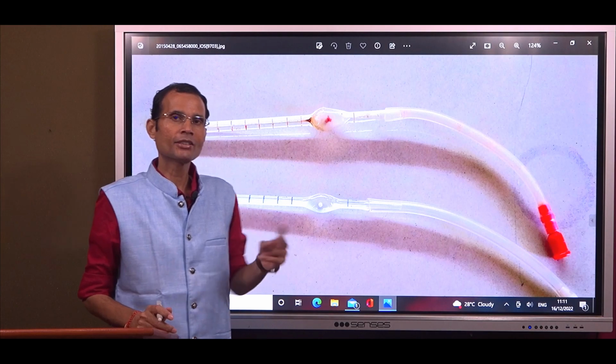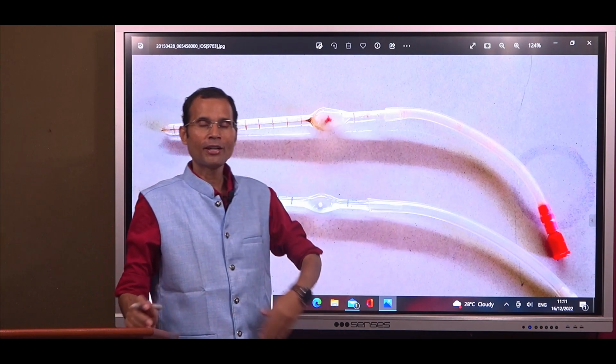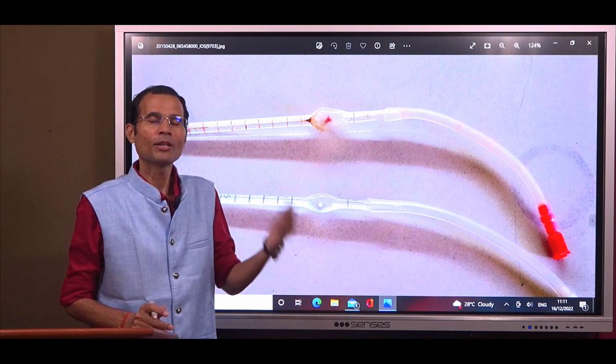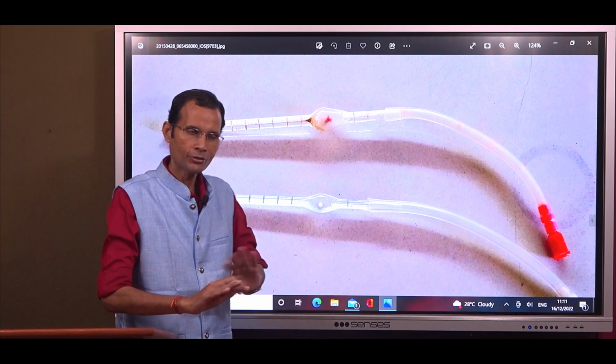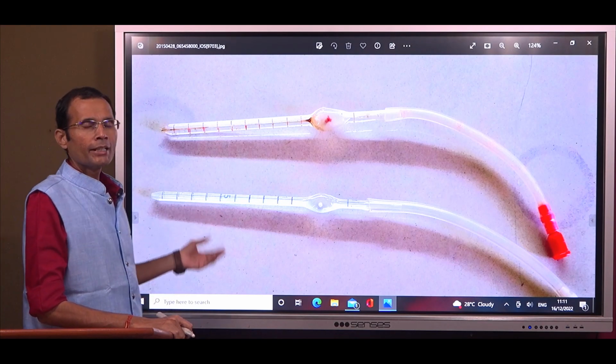Many tutors teach the other way around, that 0.5 is diluted to 101, so 1 is diluted to 202, and therefore you discard the 2 drops to make it 200. No, that's wrong.